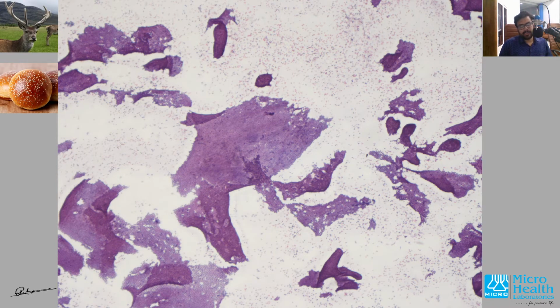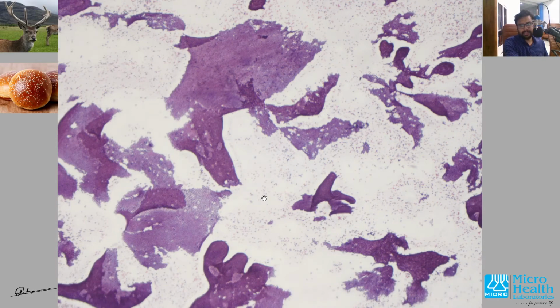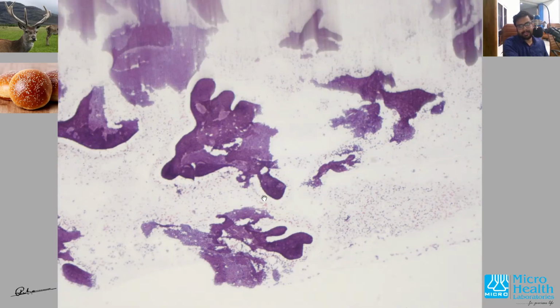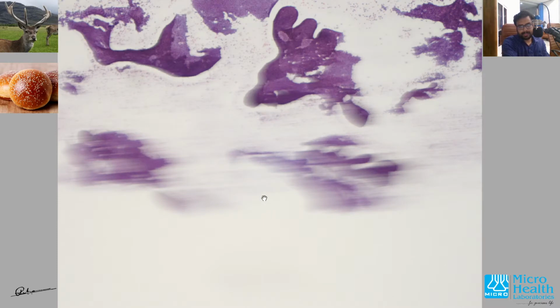On aspirating, what we see is this kind of appearance, a cellular smear, and this is what you call a sheet, in the sense of a sheet-like appearance. Then there will be another appearance that is called the antler horn appearance. Actually, it's not antler horn, because antler, I'll come to that now. I'll just show you that cluster which looks like an antler here somewhere.